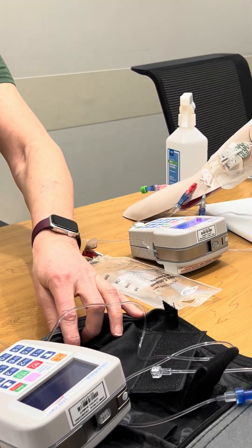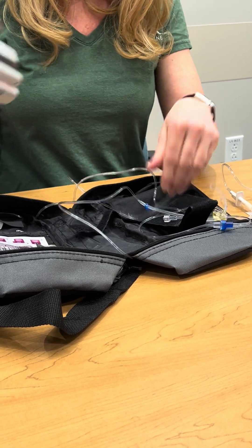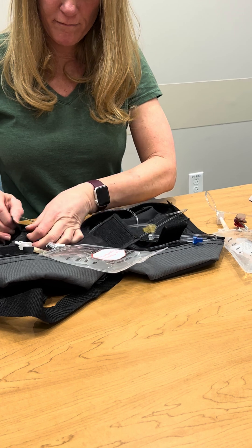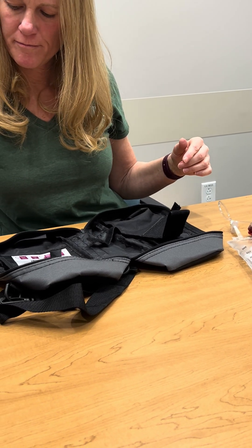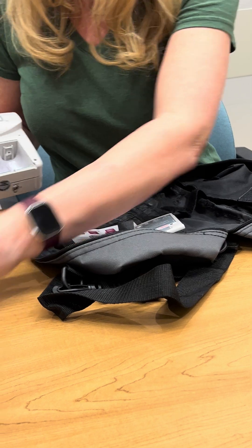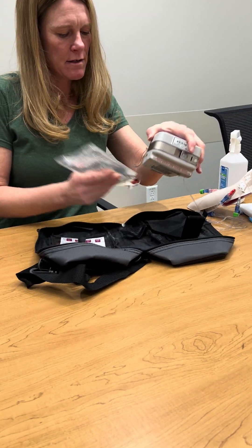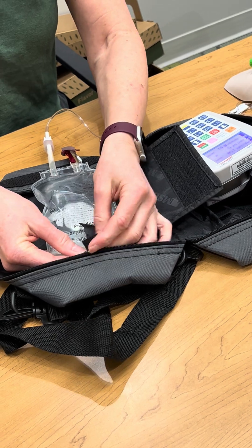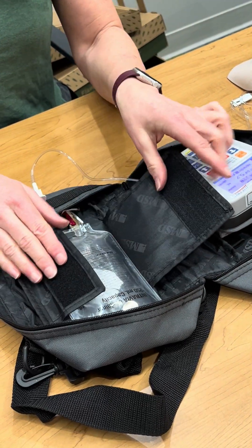Now that the new pump is infusing, I'm going to take the empty pump and get the medication bag out of it. This goes right in the regular trash. I'm going to close this up and take the batteries out so that I remember the batteries are old — discard those — and set that aside. Now I can put my new bag back into the carry bag. I use the Velcro because it holds the bag better. There is a clip here but it doesn't really hold a heavy bag, so we just fold that over on top of itself and close it.